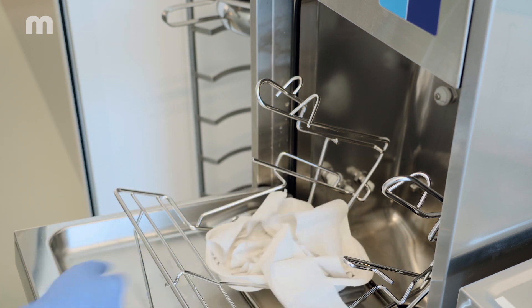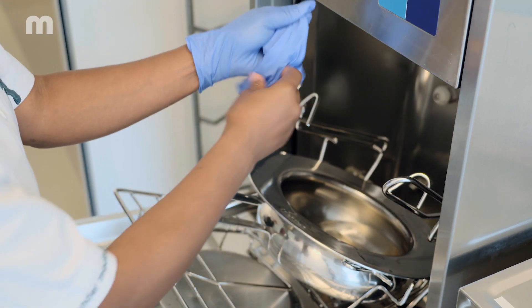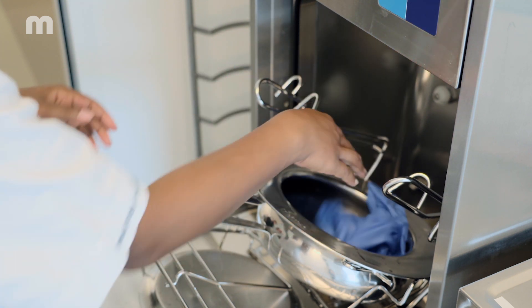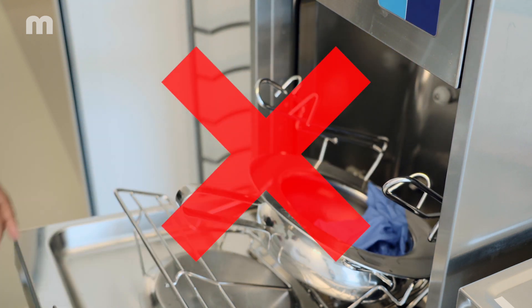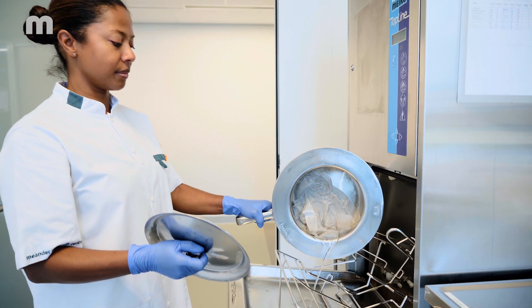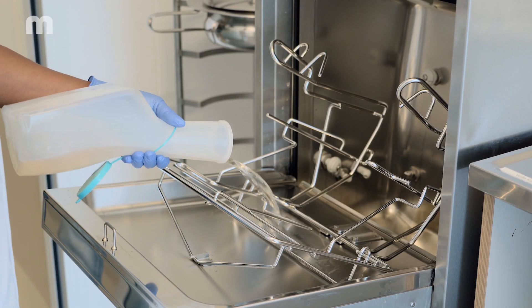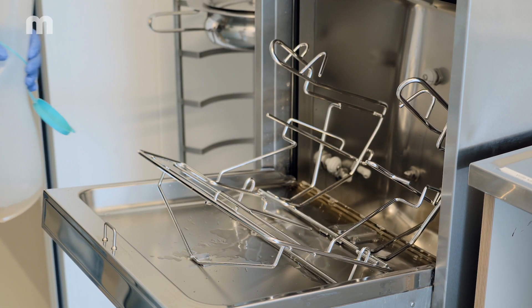Only use the bedpan washer disinfector for cleaning the utensils it is intended for — not for nappies, sanitary towels, flower vases, trays and similar things. Bedpans and urine bottles must not be emptied manually beforehand — neither into the appliance nor into a toilet or a separate slop sink.